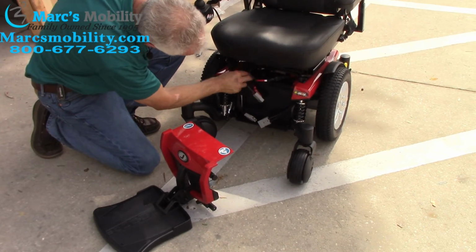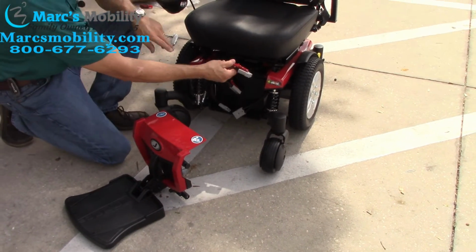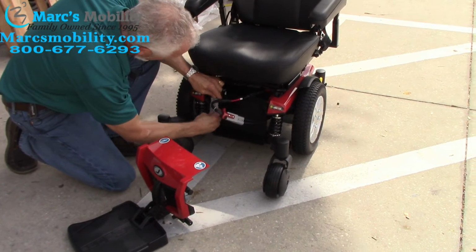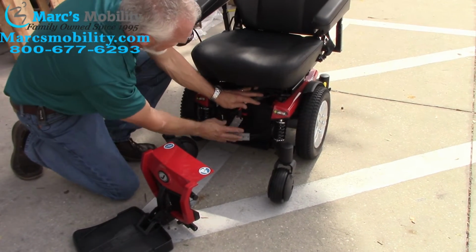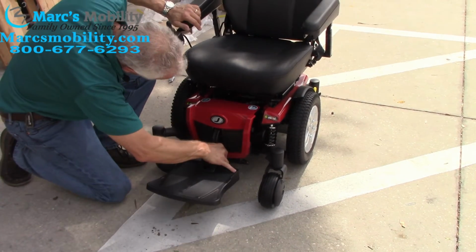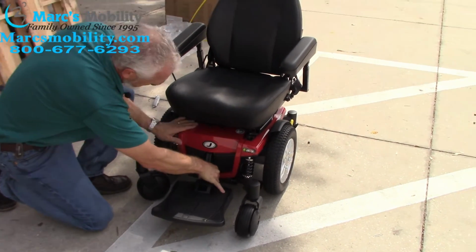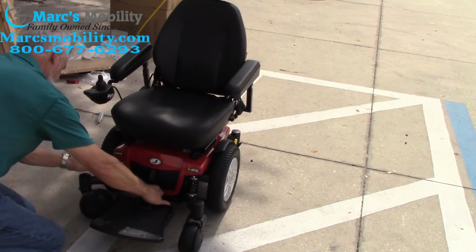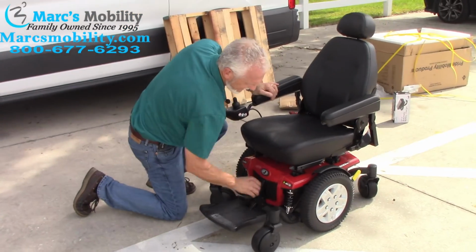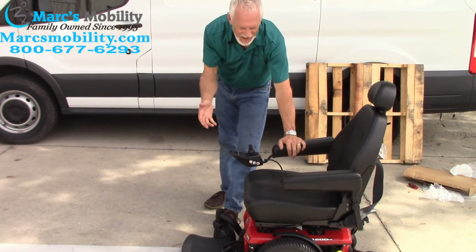You have to take the top cables and bring them out. There's one here. They're kind of pushed in there. And here's the other one. 2 cables, so you plug one cable to one battery, and you plug the other cable to the other battery, because there's 2 batteries. It takes 2 batteries to run these chairs. And you can leave the cables just like that. And then you put your cover back on. And then you snap your things again. And that might be the hardest part, taking the front and connecting them back. It's not hard, but I always have a hard time.